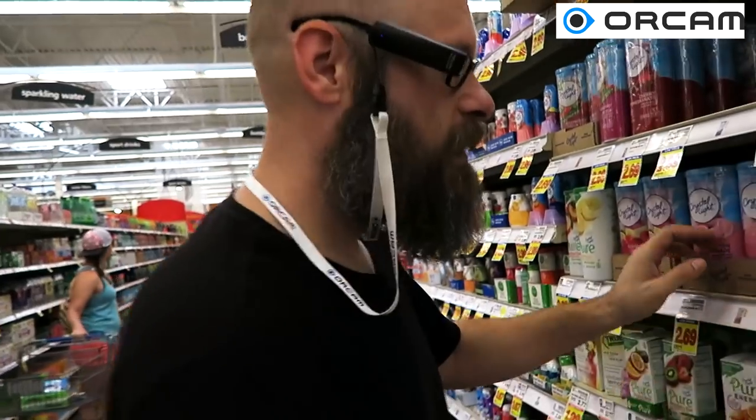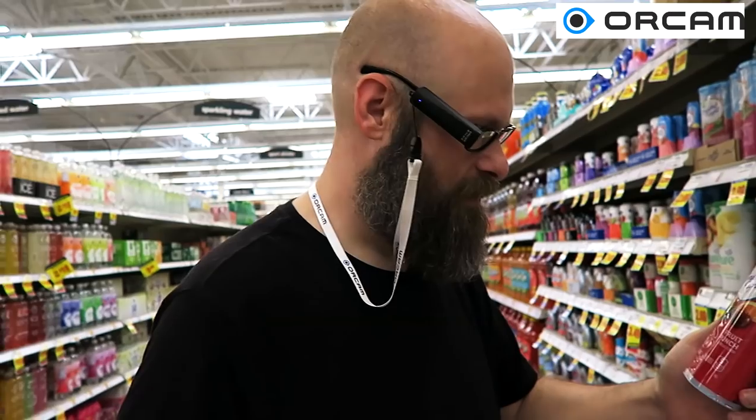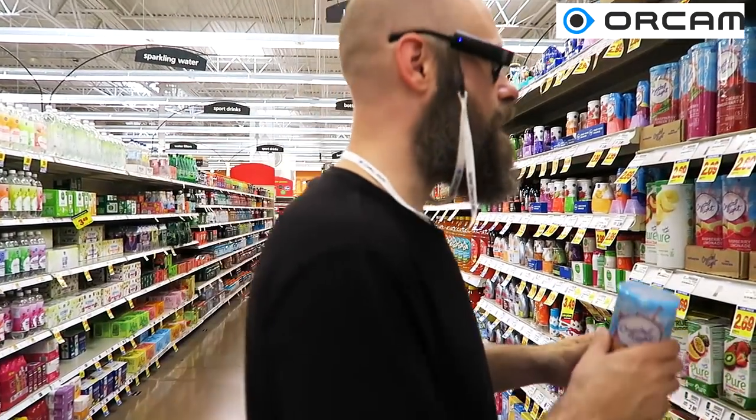So now let's find another one. Let's see what this one is. Fruit punch. Got it. All right, this is working pretty well.